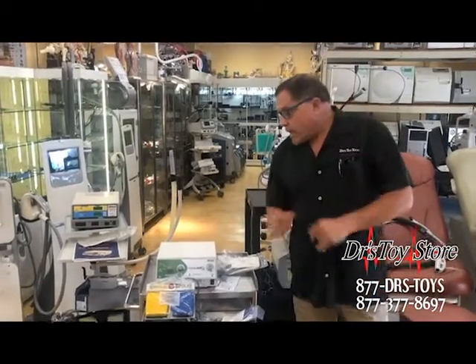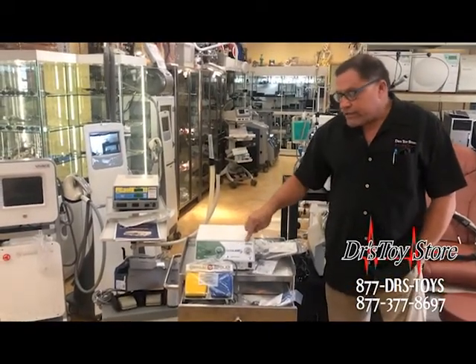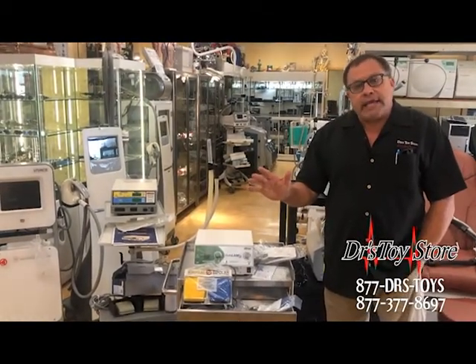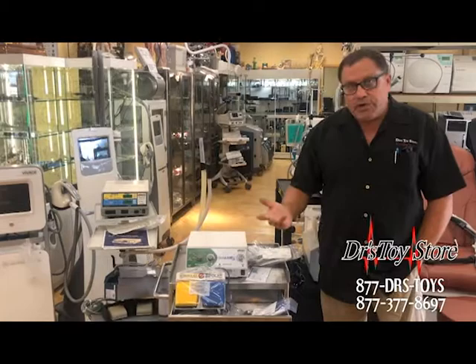Ellman Radiolase 3. We've got all your Ellman's in stock — about 20 of the Ellman Radiolase 3's. The nice thing about these is it's a different cut. It's got a cut that does not make as much scarring tissue as the Ellman's are known for.